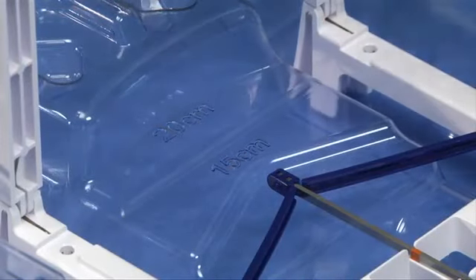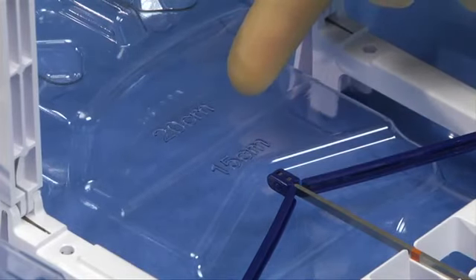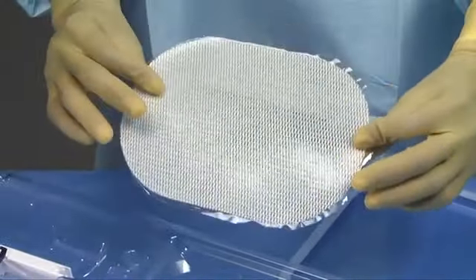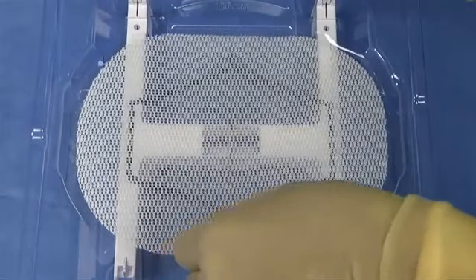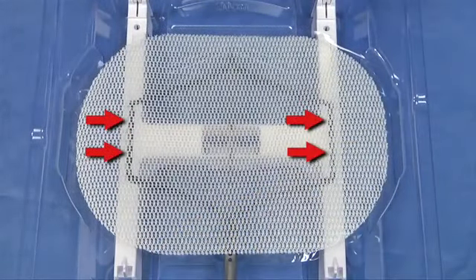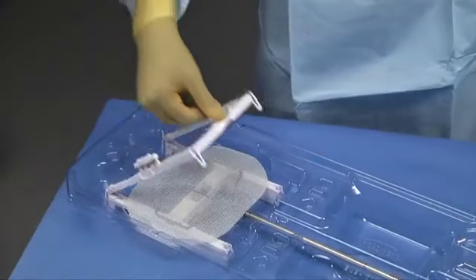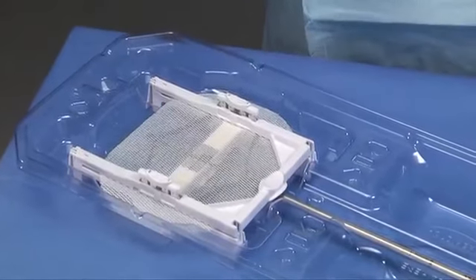The blister will have a recess that will accept the mesh and automatically position the mesh to the center of the frame. Place mesh with the barrier or visceral side down and parietal side up onto the deployment frame, avoiding finger contact with clips. Close the frame until an audible click is heard. The frame is now locked in the closed position.